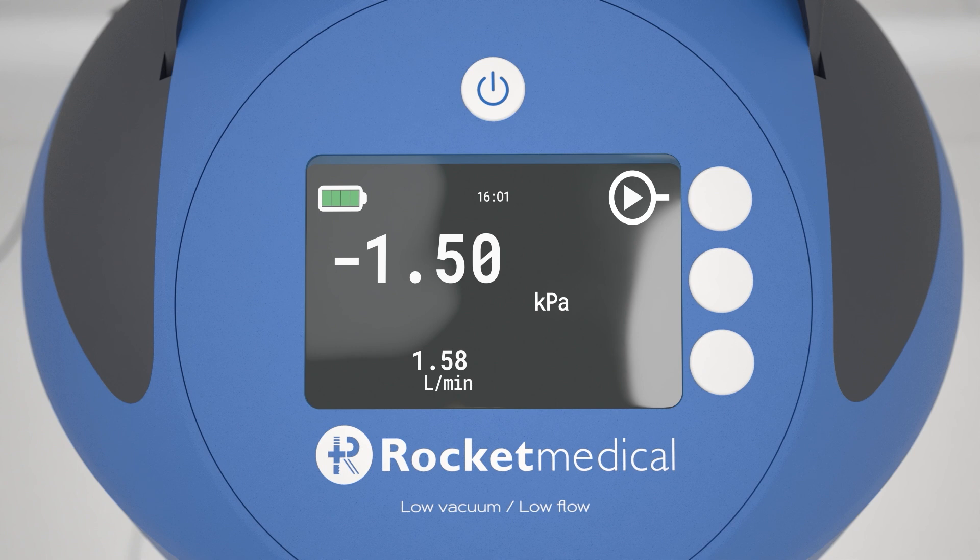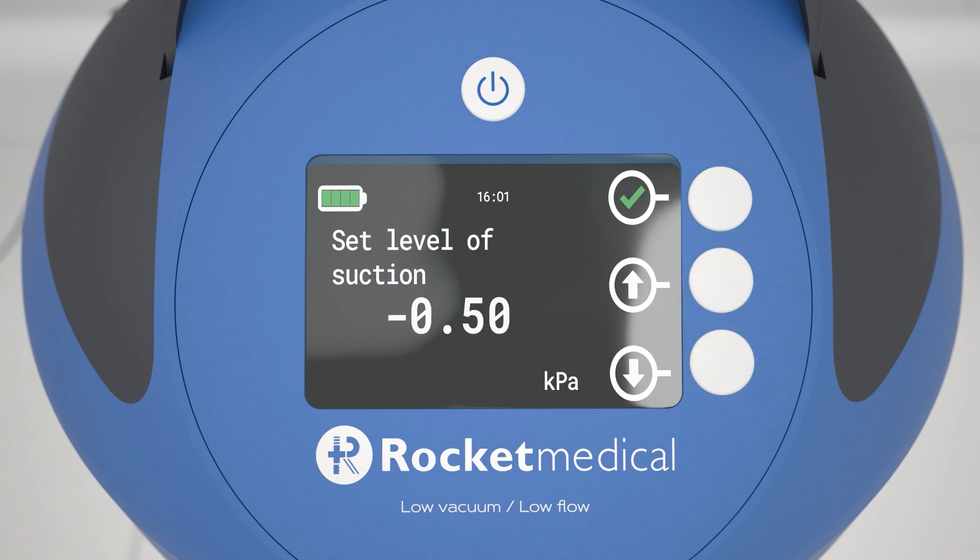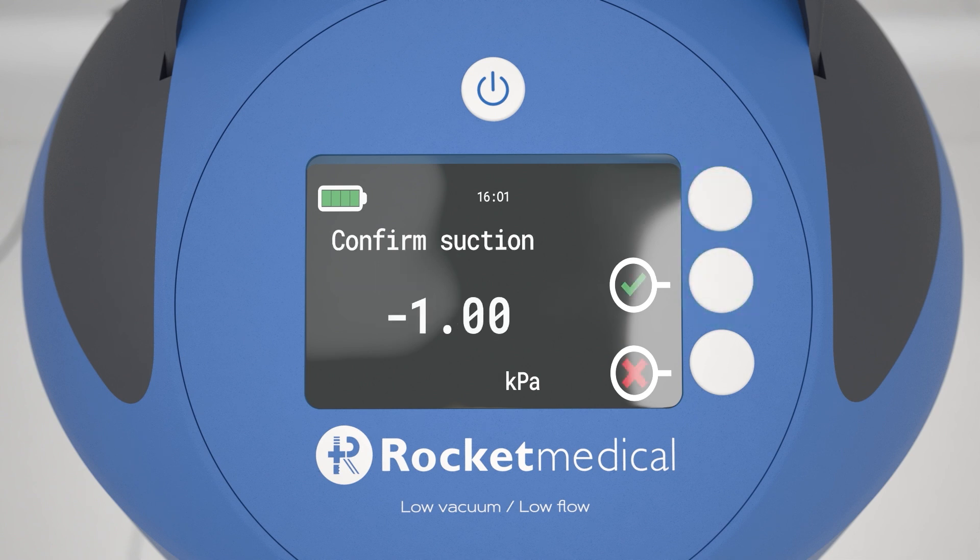To change the suction level, press buttons 2 and 3 together for longer than 2 seconds. This will return you to the suction level setting screen. The PSU gravity drainage option allows for measurement of the size of the air leak with very minimal suction being applied. Set your prescribed level of suction and confirm this by pressing and holding the button for more than 2 seconds. The PSU will start to apply suction to the chest drain unit and the patient.